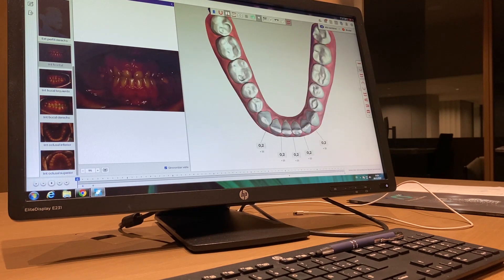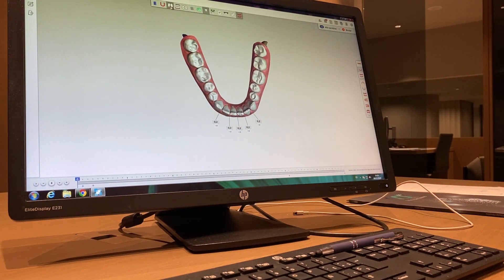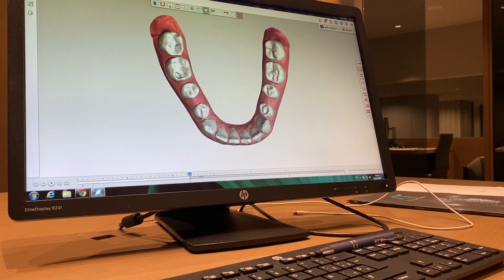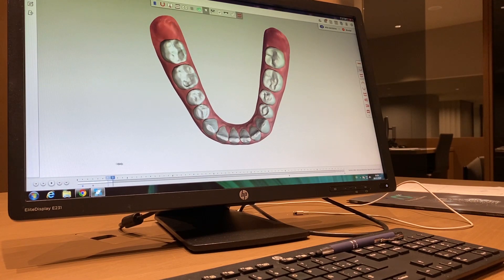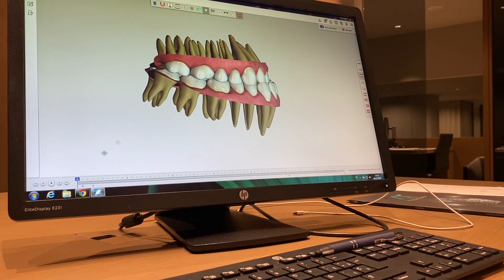My treatment plan: I have the wisdom teeth, and I'm going to do the extraction of the wisdom teeth. So at aligner 3, I do the extraction, and then I start with lower molar distalization every four aligners — 1, 2, 3, 4. The key point is to do some compression of the 7s, distalizing and rotating them distally, and not moving more than three posterior teeth at the same time.